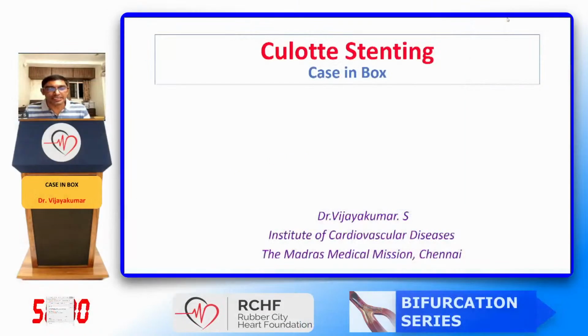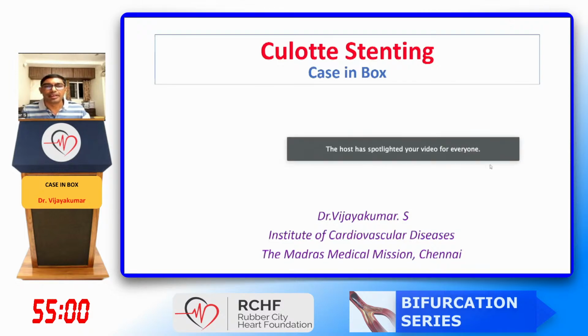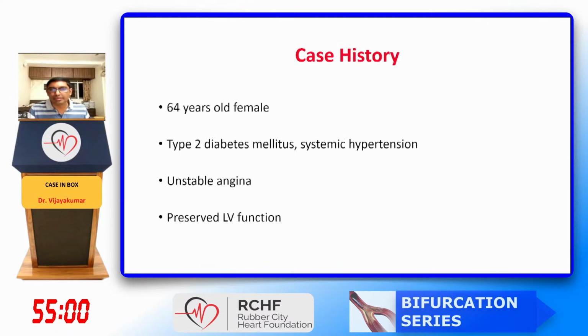Thank you so much, Natarajan sir. Thanks, Deepak sir and others for inviting me for this meeting. Can you see my slides? Yes, very much. So we'll start this case in the box. Sorry, this is not a fully recorded case. We didn't have an opportunity to record it, so you may find bits and pieces missing. It is a routine case done, so I'm just putting it for presentation here.